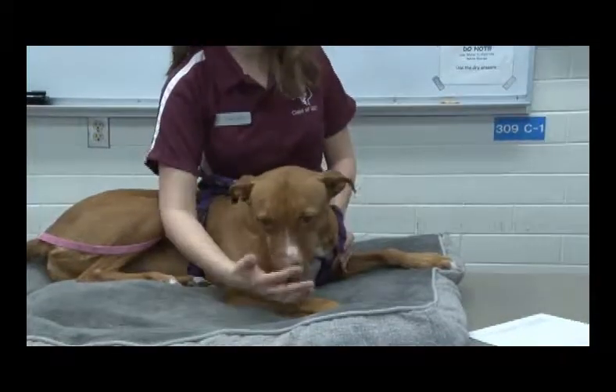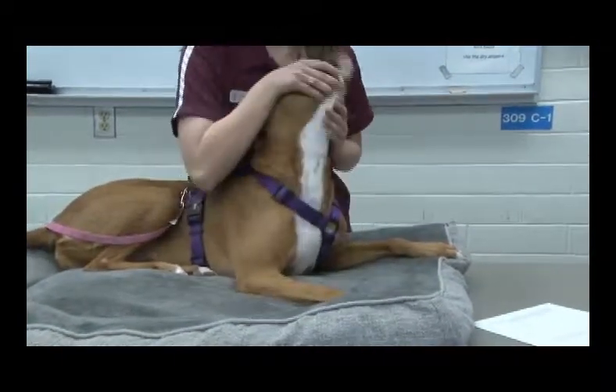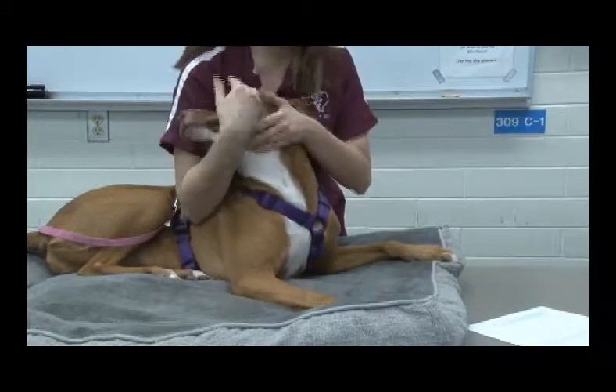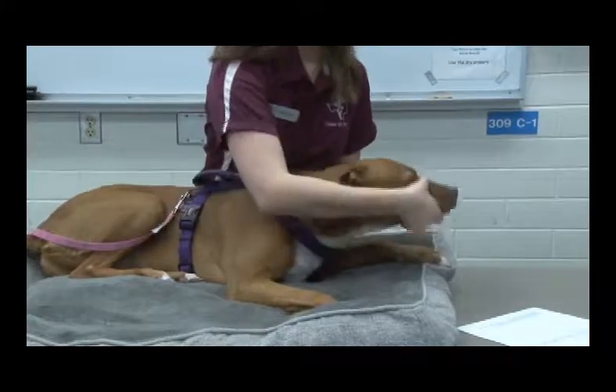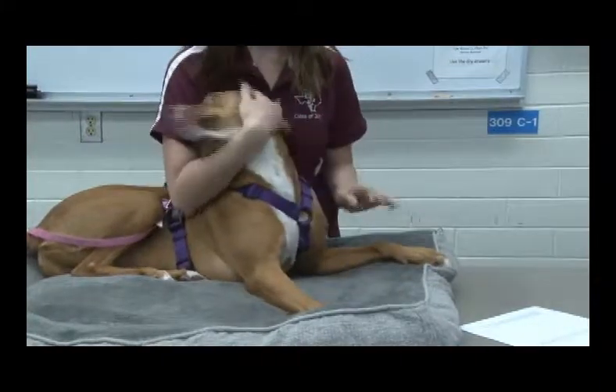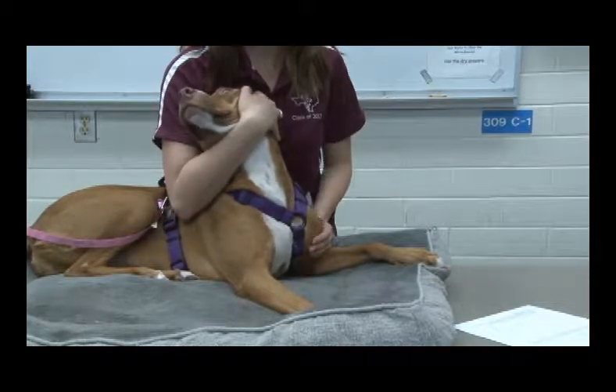You're going to reach over the animal, as I am. You're going to extend the neck upwards and point the head away from yourself, so that if they did bite, they weren't biting at your face. Once you have that done, the legs are going to be over the edge of the table — Kelty is being very cooperative right now, so we're not going to do that.